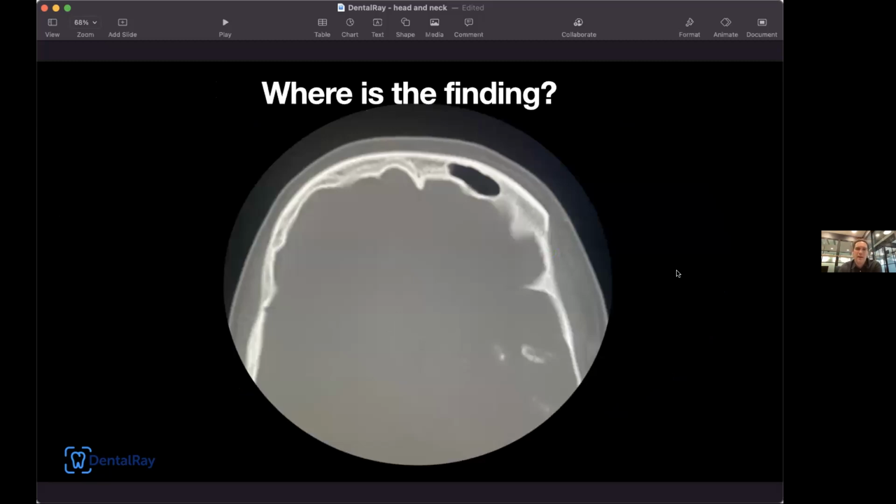Okay, this one I don't think we can do a raise of hand because we're not going to write in, but this gets into the fact that with some of this cone beam CT, we're way outside of the oral cavity. We can even choose to do that, as Garry and Eliot and Christine pointed out. We can choose to look at the entire paranasal sinuses and expand the field of view on purpose because we want to get more information and help the patient and save them the hassle and expense.